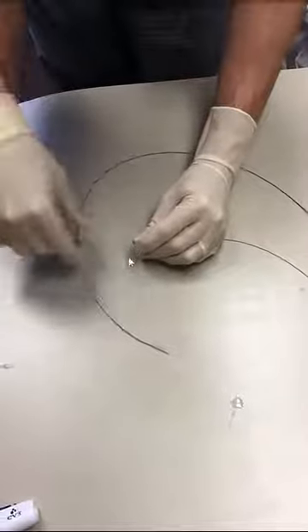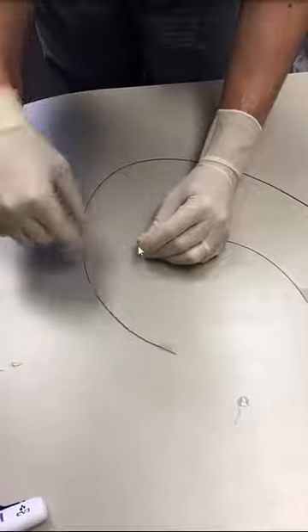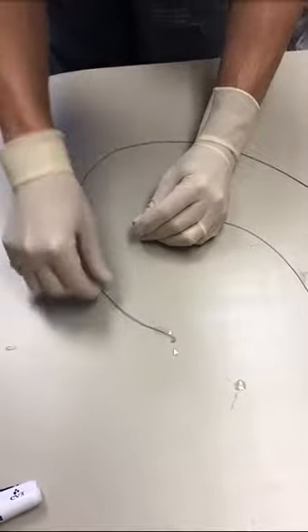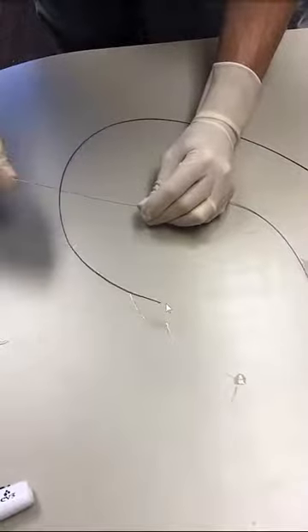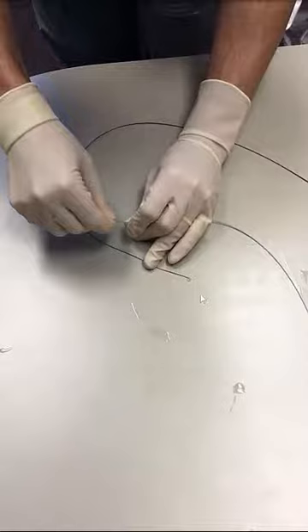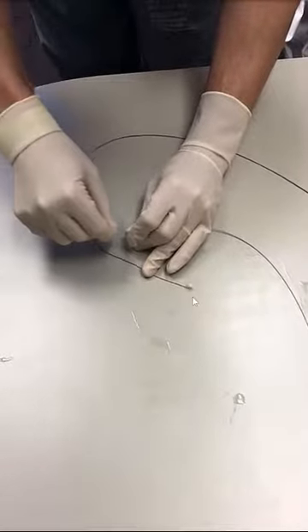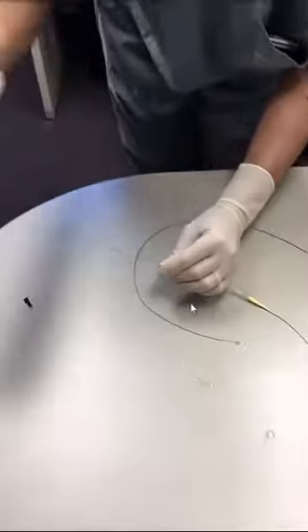This coil is a so-called detachable coil, which means that it is connected with the tip of a delivery wire and is now exiting the tip of the catheter. It is very, very soft and atraumatic. If we don't like the location, we can pull it back in and then redeploy it until we're completely satisfied with the location of the coil.